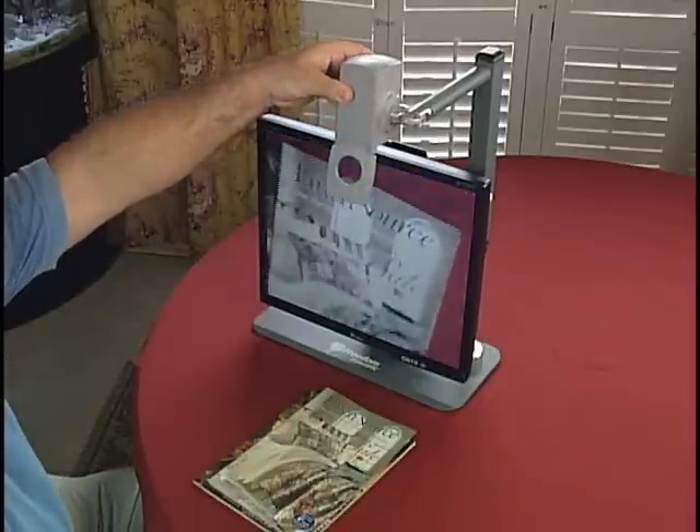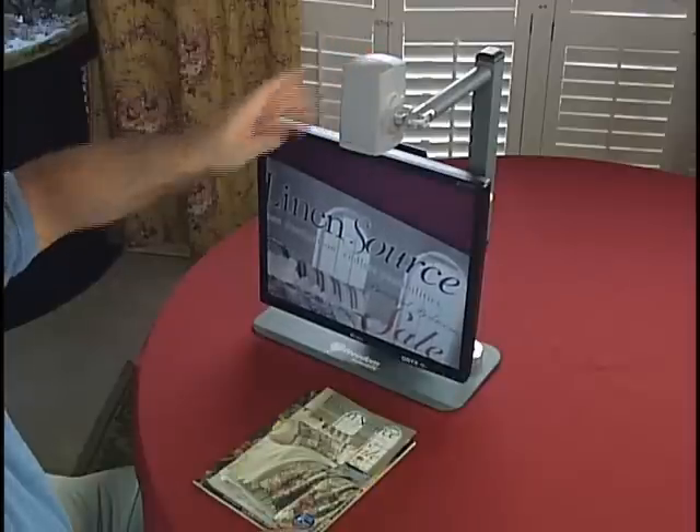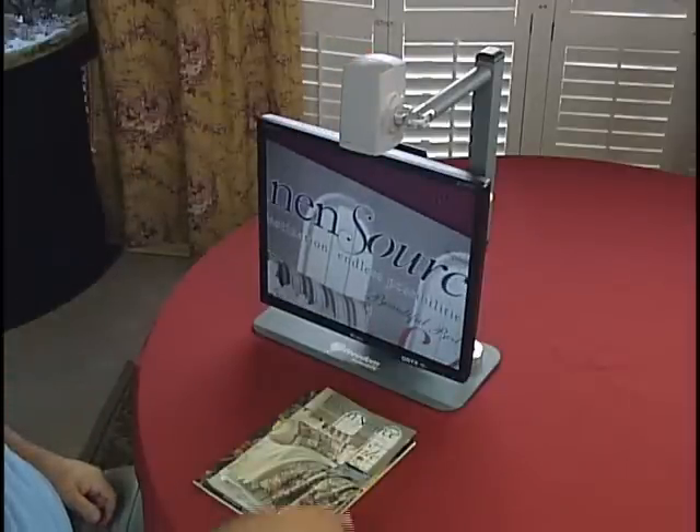When I bring in my mail, I just flip the camera down and sort the junk mail from the bills.